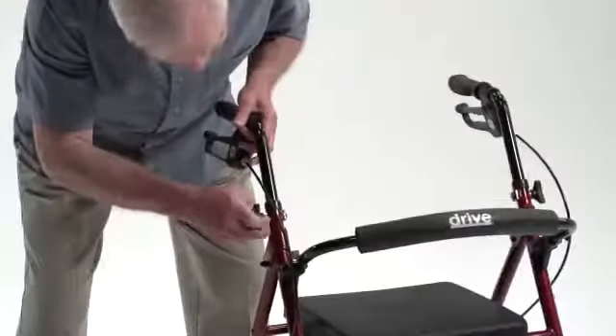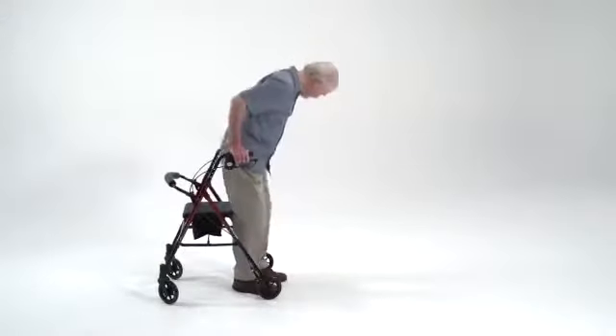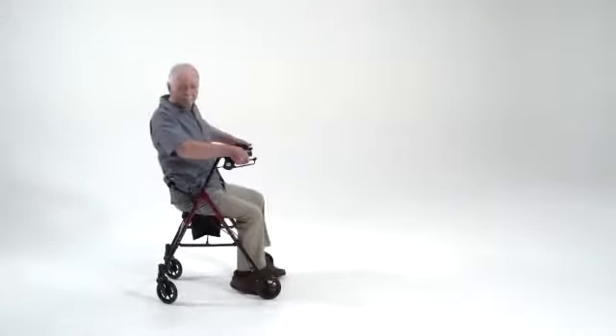The height of these ergonomic handles can also be adjusted as much as 8 inches for a more confident grip. When rest is needed, the padded seat and backrest makes sitting comfortable.